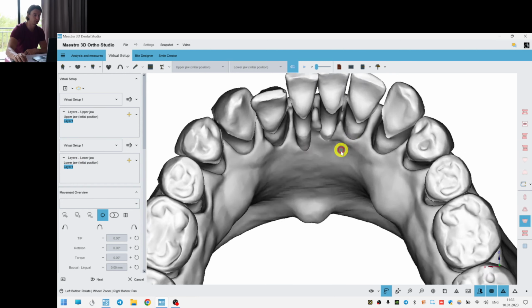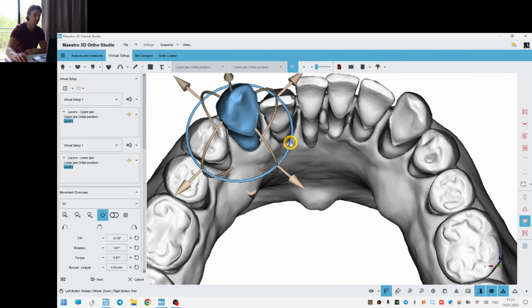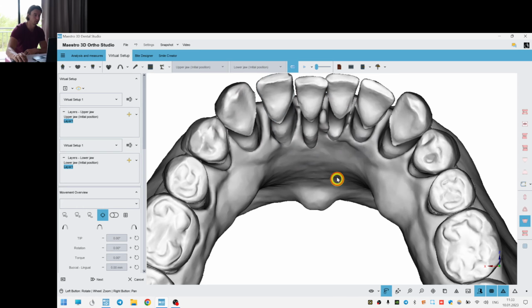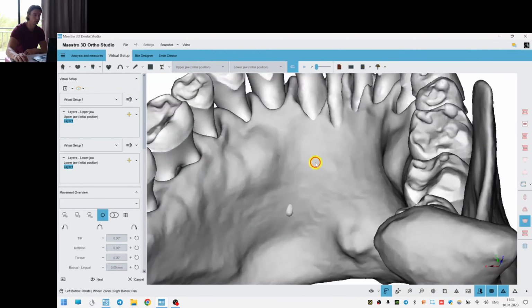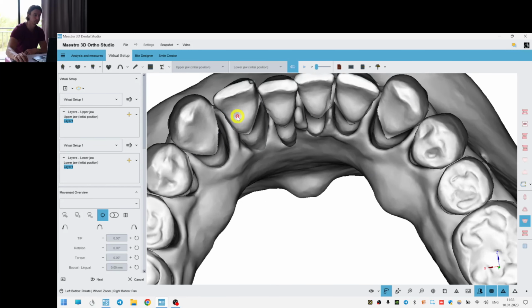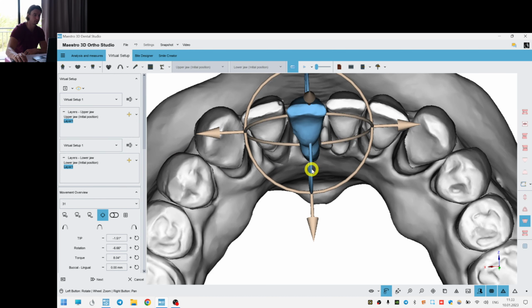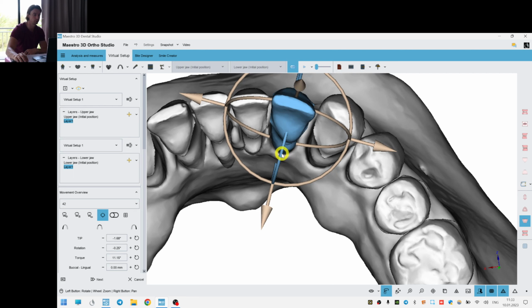I'm not sure if it's imperfections of the accuracy of the CBCT scan or it's real image. We'll check it later. So at layer 1 we expand with some overcorrection so that we see some gaps between the teeth. It's okay.